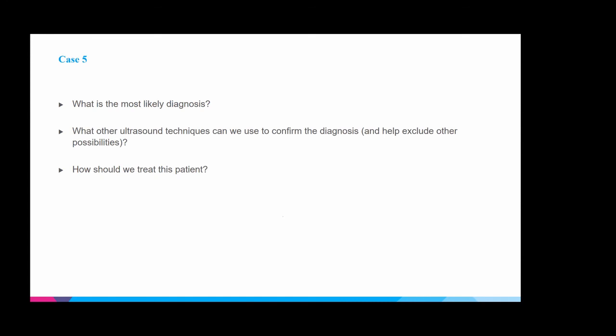Oh, sorry. Shred sign is going to be for subpleural consolidations. It's called lumpy bumpy or fragmented pleura is what we're looking for. It's a very scientific name, lumpy bumpy. But basically, if the pleura looks very irregular, not smooth like it should under normal circumstances, that would be more indicative of a non-cardiogenic pulmonary edema picture. In this patient, we only had the body probe, so we couldn't really look that closely at the pleura. But for the purposes of this case, I would agree the most likely diagnosis would be acute pulmonary edema from the hypertension.